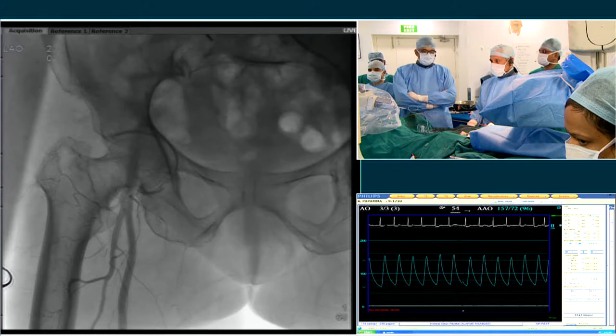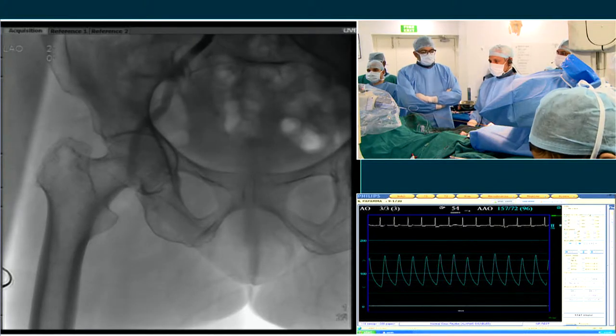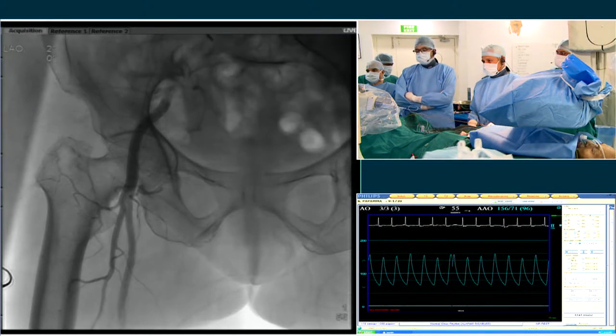There's always a trade-off of hemodynamics versus right sizing the valve. And in this scenario, we thought a 21.5, and I actually called Ravinder Rao, just to get his opinion because he has a lot more experience with MyVal. And he said also that he would do a 21.5.